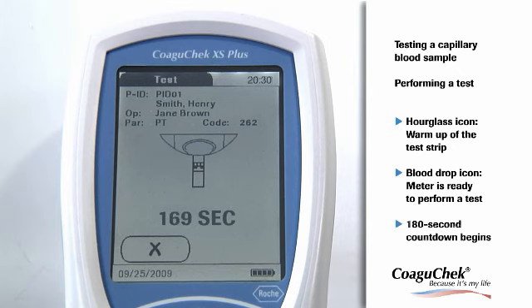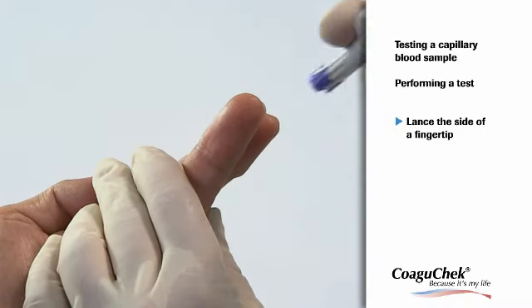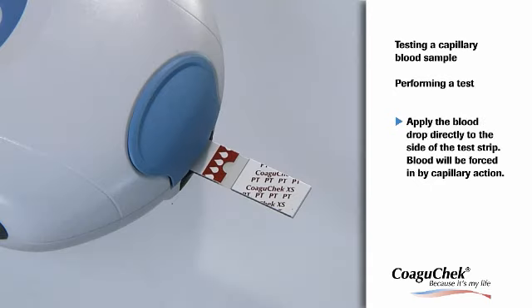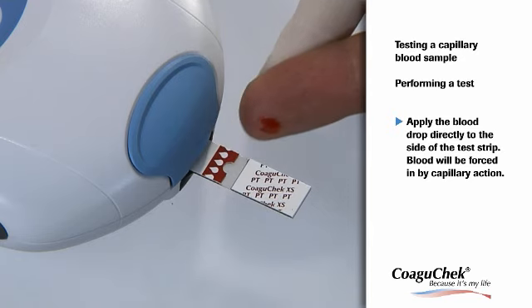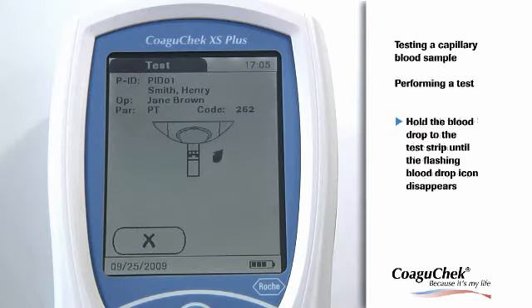At the same time, a 180-second countdown begins. You have to apply the drop of blood within this time frame, otherwise you will receive an error message. Now prick the side of a fingertip with the lancing device. Apply the first drop of blood from the finger within 15 seconds of lancing the fingertip — applying blood after this period of time would falsify the result. Apply the blood from the fingertip by touching the blood drop against the side of the sample application area. Alternatively, the blood can be directly applied from the finger from above the transparent sample application area of the test strip, or a non-heparinized capillary tube can be used. During the application process, you must hold the blood drop to the test strip until the flashing blood drop icon has disappeared.